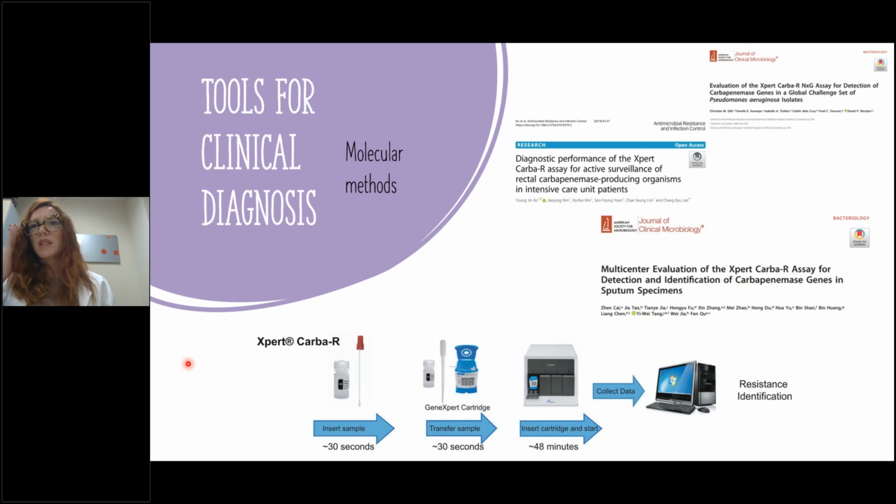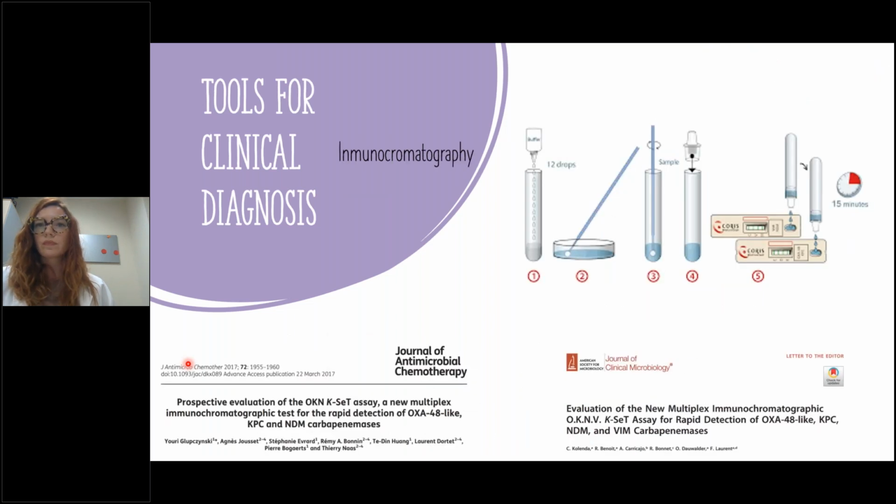There are a lot of published papers evaluating this technology, and all have very good results. Another technique which is very interesting because it's cheaper and it is fast and easy to use as well is immunochromatography. The most used, I think, is this one from Coris, which you can see in the image, but I think all of them work more or less the same.